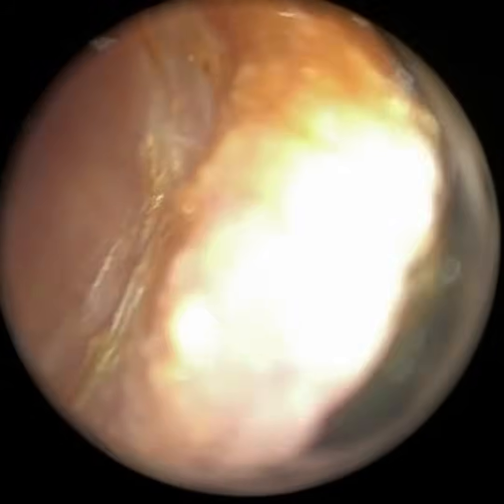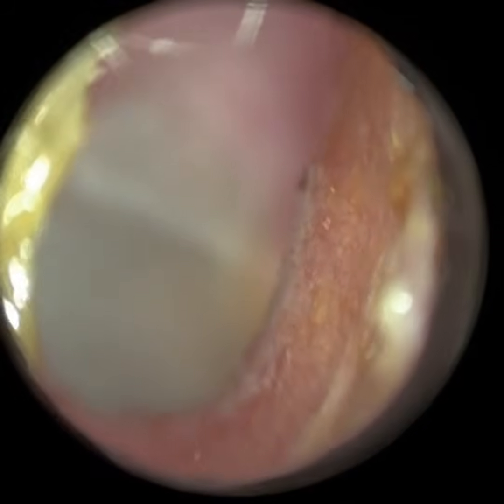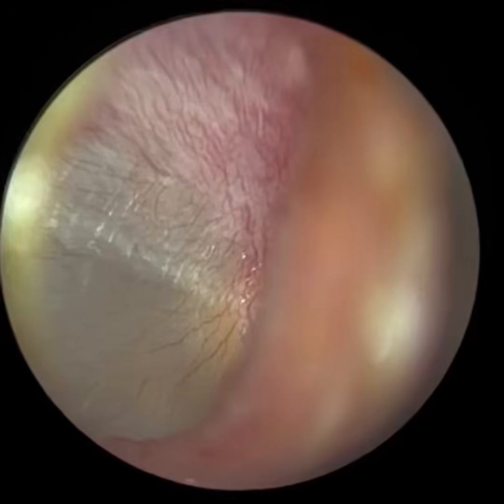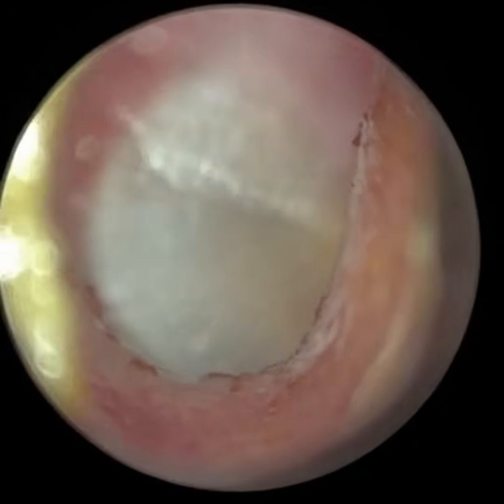And you'll see in a moment when we re-enter, you'll see half the hammer bone, the malleus. You just won't see the anterior quadrant. And I will freeze that. I could have tried to use the size 1 specular, but I wasn't really going to get any improved view. So I've just paused that there. On the right-hand side, you've got another half of the eardrum not visible.